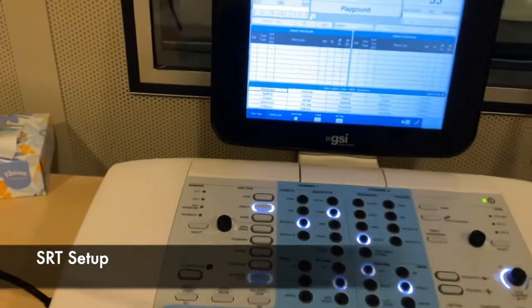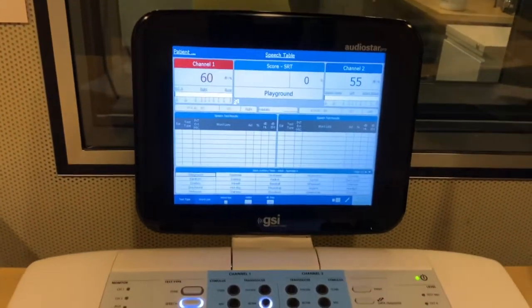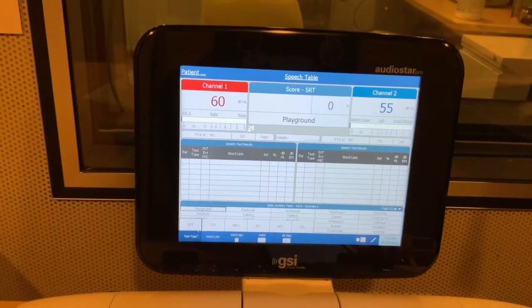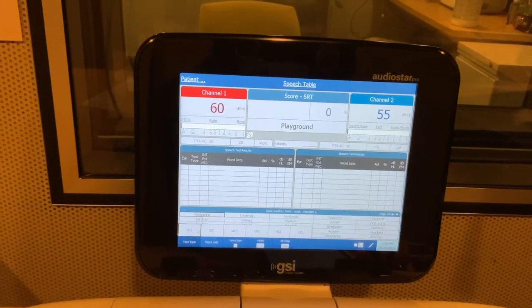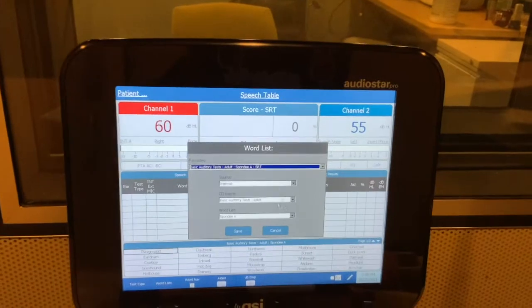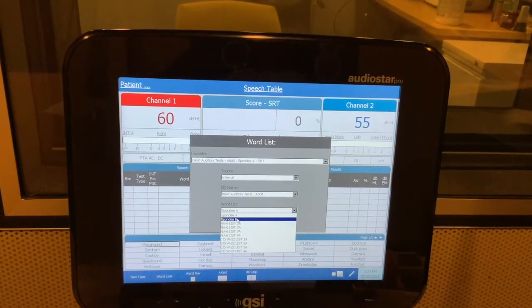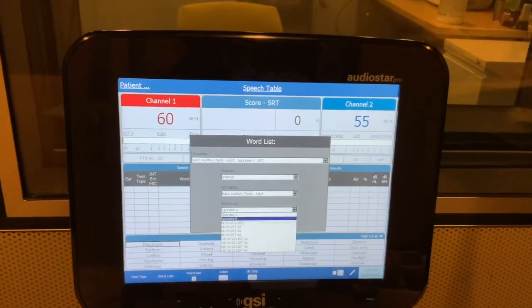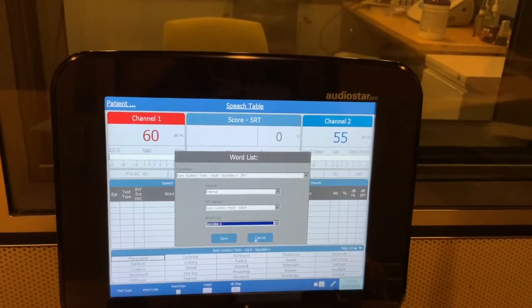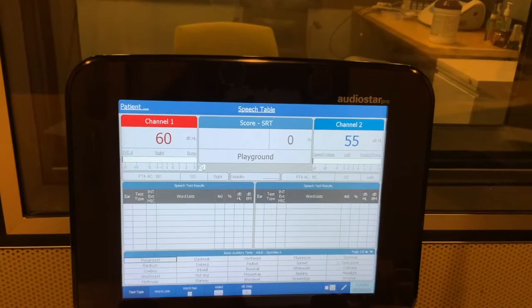As you can see, I've already set it up with speech, and I have a clear screen. To choose the test type, you're going to hit test type, and right now we're doing SRT, so I'm clicking here. Again, with the word list, we want to make sure that we're doing spondees. So you have a choice of spondee A or spondee B. It doesn't matter which one you choose, as long as you choose spondees. And then we'll hit save, and it'll load up here. And now we're ready to start testing.